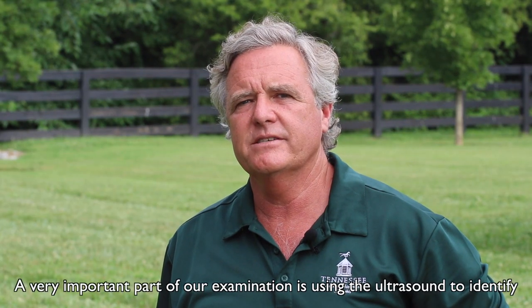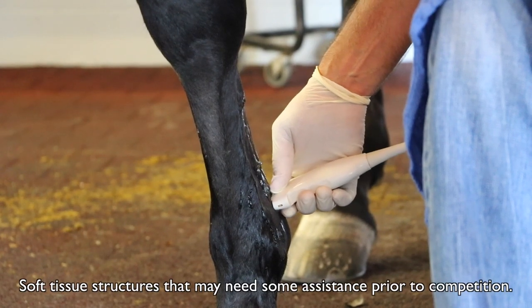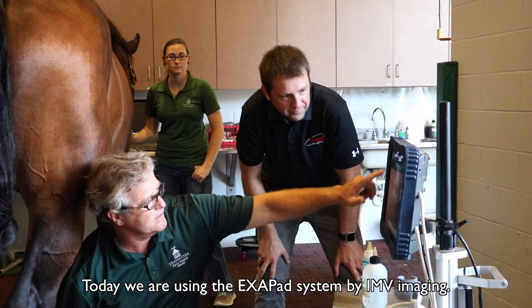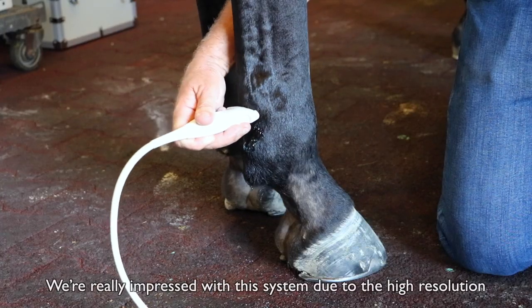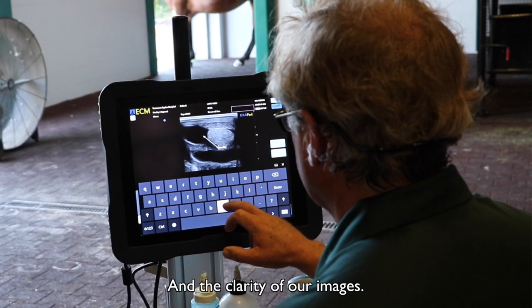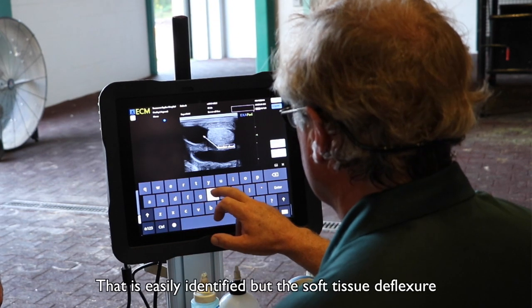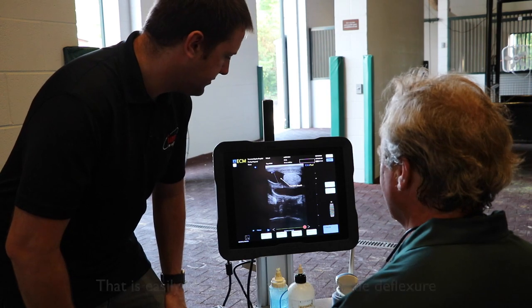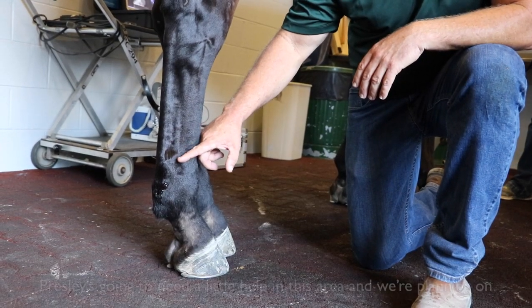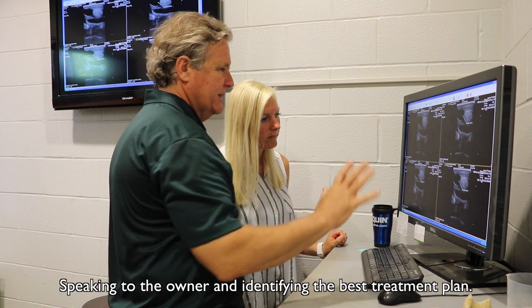A very important part of our examination is using the ultrasound to identify soft tissue structures that may need some assistance prior to competition. Today we're using the Exapad system by IMV Imaging. We're really impressed with this system due to the high resolution and the clarity of our images. As you can see on the screen, there's some swelling in this tendon sheath that's easily identified, but the deep digital flexor and superficial digital flexor are both very healthy. Presley is going to need a little help in this area and we're planning on speaking to the owner and identifying the best treatment plan.